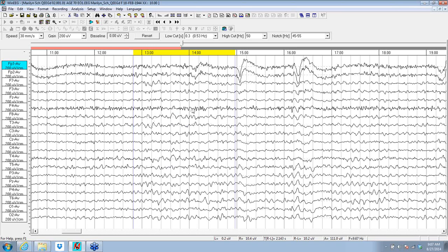What was happening in our previous perspective of this was that the temporal lobe source of this was contaminating the ear reference. And the ear reference was giving us a widespread distribution when it really was only coming from the temporal lobe. So what we've got here is, in fact, a change in function in the temporal.